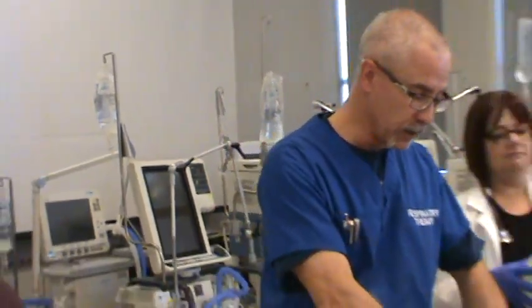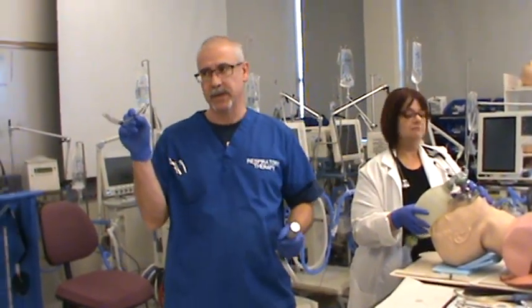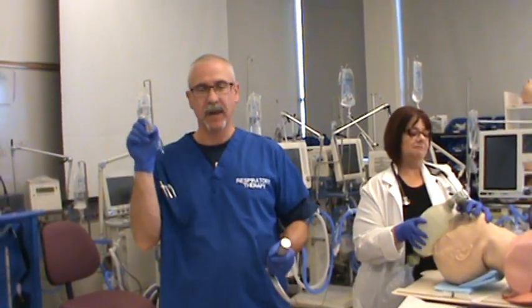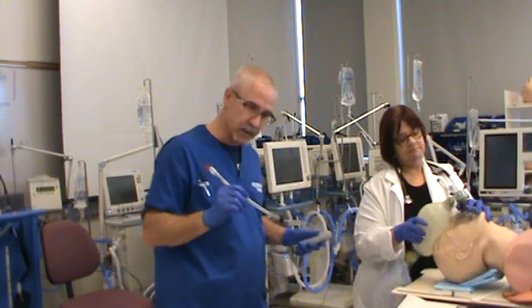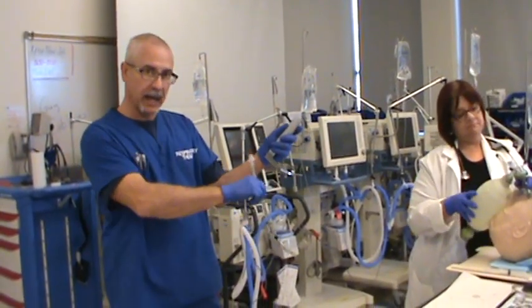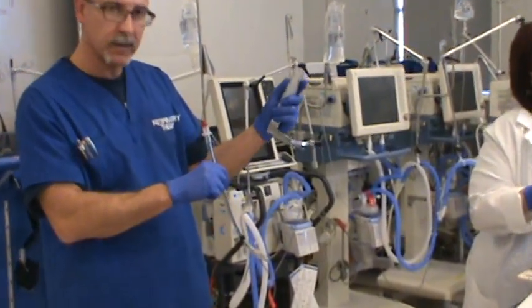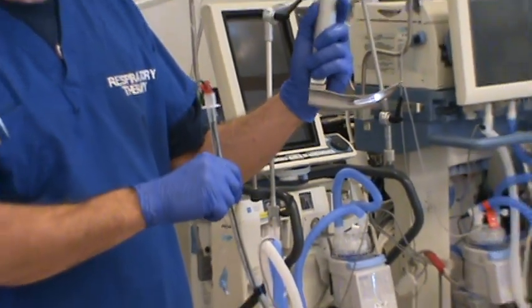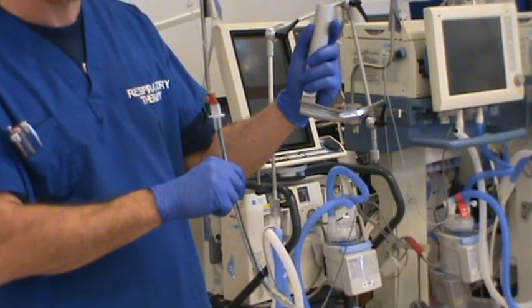You'll be holding your endotracheal tube in your right hand. I like to grab it right around 22 centimeters so I know when my fingers hit the patient's teeth, I've got the tube in at a sufficient length. To get in the proper position, I like to take my hand and my arm and lock them in one position so that my wrist stays nice and straight, and I don't get into the habit of moving my wrist.